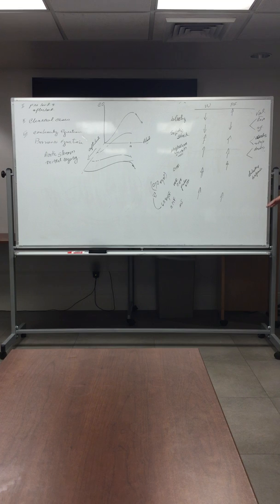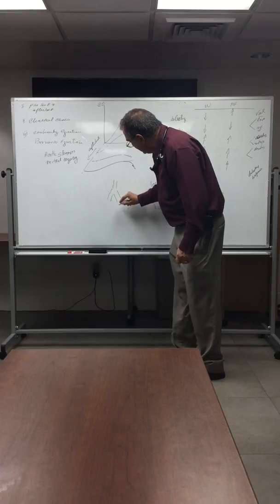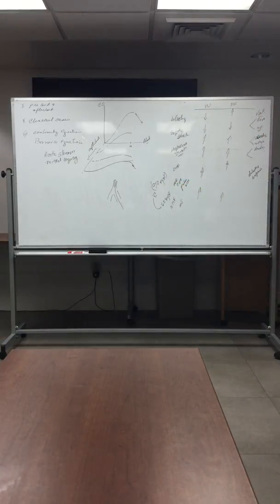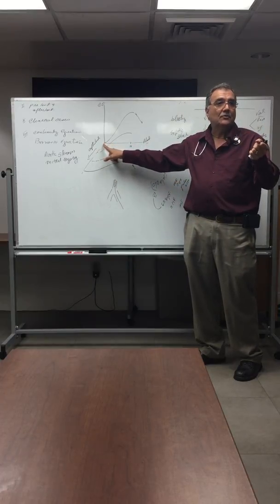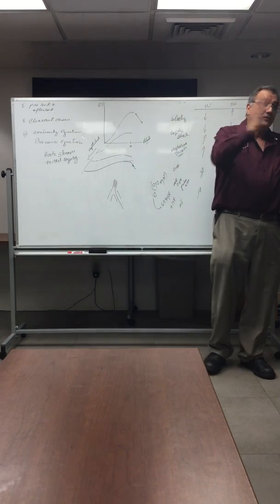And the way that works is that they go ahead and they put, you have the aorta, it's at the femoral arteries, they put a balloon inside the aorta. And when systole takes place, the balloon deflates. When it deflates, it essentially creates a vacuum inside the aorta. And that vacuum essentially drops my afterload tremendously over here. So now the heart muscle can contract without feeling any resistance, number one. Number two, when in diastole, it inflates again.